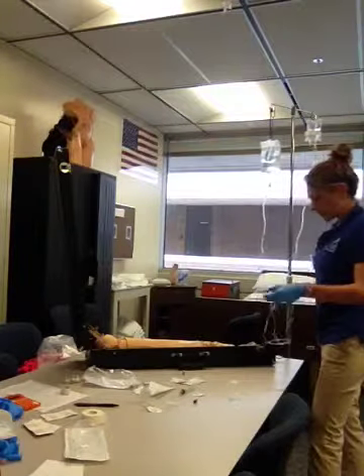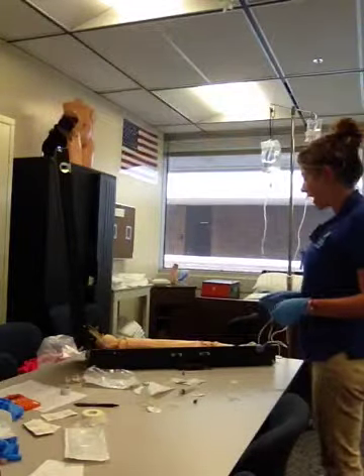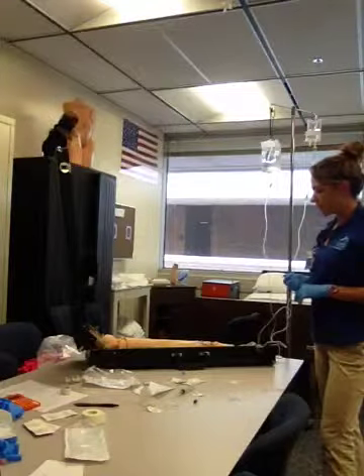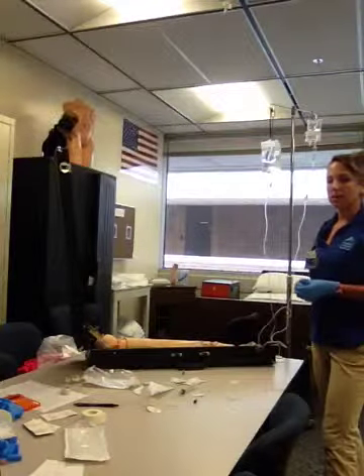Are you feeling comfortable, Mrs. White? Good? All right. Periodically over the infusion time of 30 minutes, I'm going to come back and monitor the site and assess for any signs of a skin rash or anaphylactic reaction. Also, I'm going to keep in mind that this drug can be ototoxic and do damage to the kidneys and the liver.